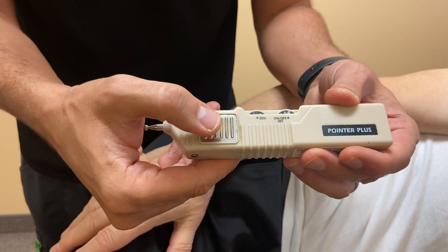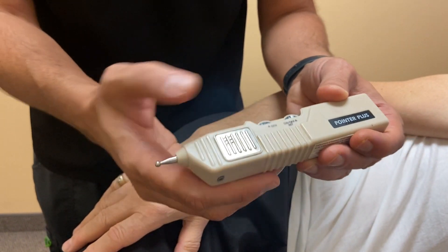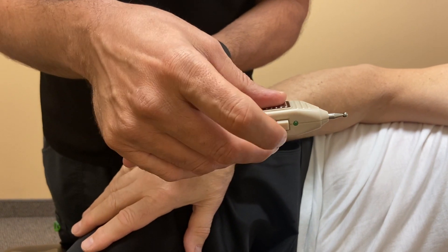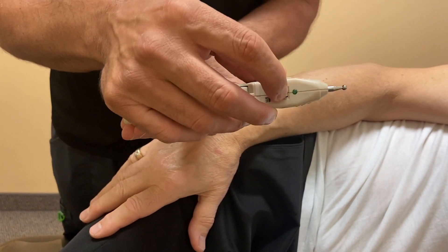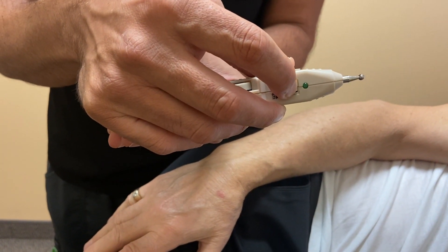The next thing is the plate itself — this is the grounding plate. In order to turn it on, we must have our thumb or finger on the grounding plate, then with our other hand compress the button, and we should see a green light light up. That tells us that it's working.